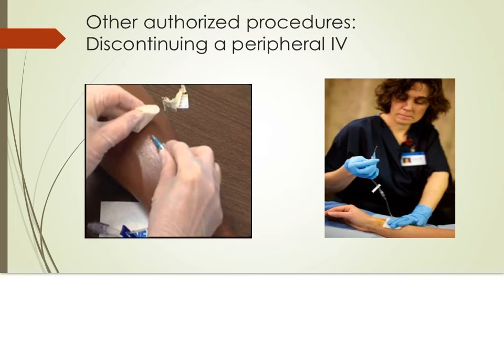After the cannula is out of the skin, immediately press the 2x2 gauze over the site. Continue to apply firm pressure until the bleeding stops. If the patient is on anticoagulant therapy, pressure may need to be maintained for 5 to 10 minutes or longer. When bleeding has stopped, replace the gauze with a clean gauze pad and tape in place only after you have cleaned the site with alcohol and scrubbed for a minimum of 15 seconds.